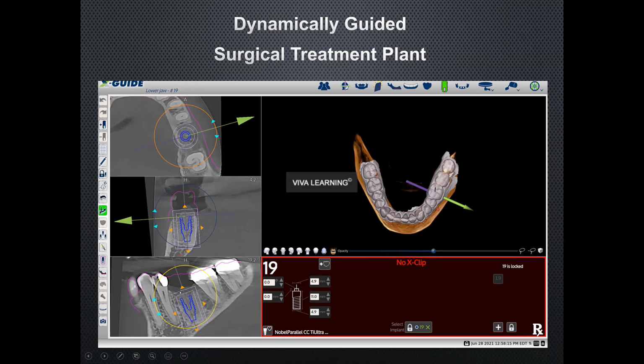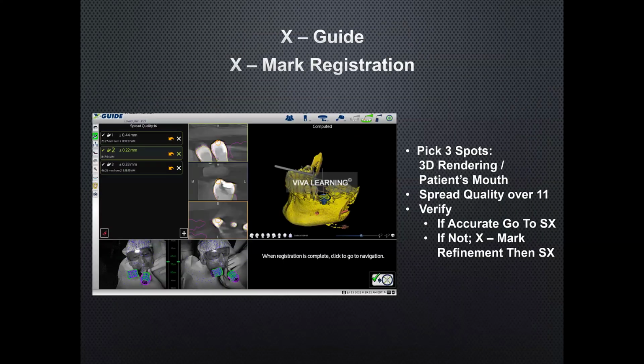The squares around each are 1.5 millimeters and 3 millimeters, so we can tell how far we are from each tooth. And we can also look at the model and see if we like the emergence profile of our implant, and also to look and see, hey, is it in the center of the fossa if possible? And let's design this to have a screw-retained implant crown to help us even better with no peri-implantitis, to alleviate the chance of having cement.